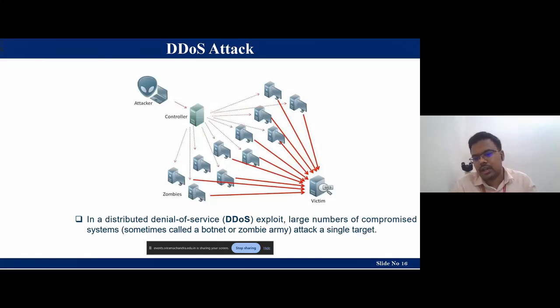It's one of the worst attacks in a medical scenario. Take a pacemaker, an implanted insulin pump, a drug delivery system, cardiac ICDs, or a gastro stimulator. Whatever device you take, they are connected. They are very lightweight devices, connected with Bluetooth or Wi-Fi to external devices. So if too much data comes to those devices, they definitely will not give proper service to the patient. This is the main problem when it comes to device attacks.